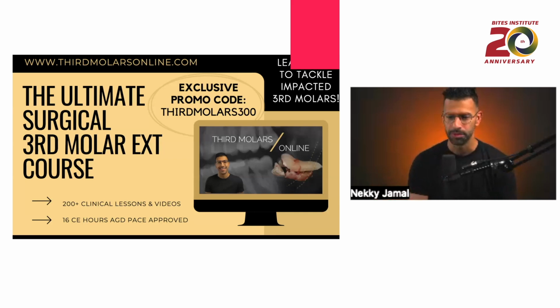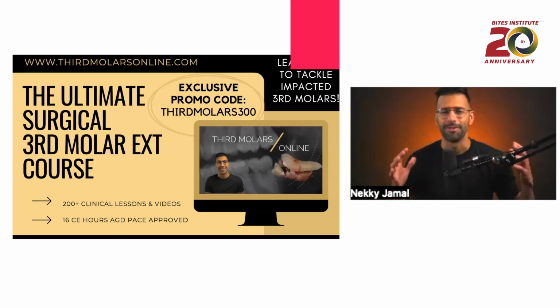I have very few post-op concerns, but it all goes down to knowing what you're doing when you're going to take out that third molar. You have to know how to make that flap, how to section the tooth, how to clean the site well, put PRF in there, and then how to suture.